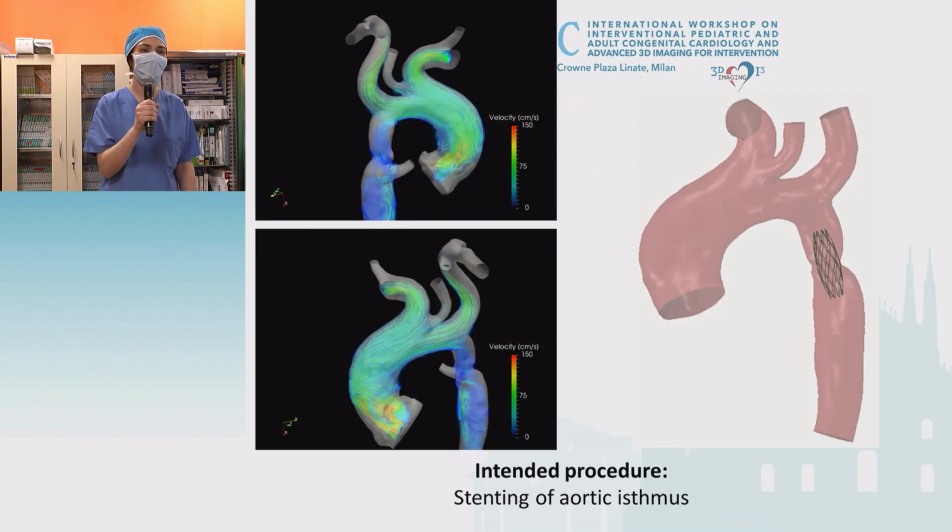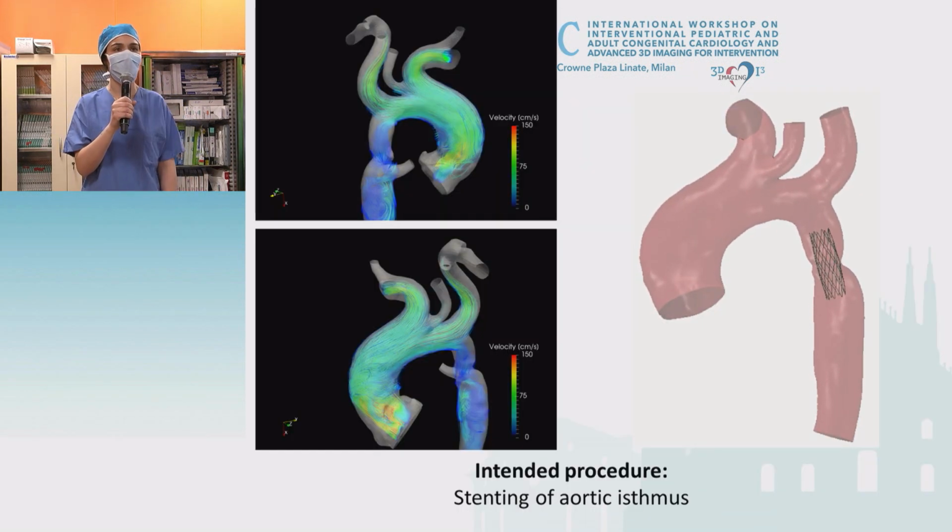So here, our bioengineering processes the imaging. You can see on the left the 4D flow acquired on MRI. You can see there's a particular shape on the ascending aorta that is probably due to the bicuspid aortic valve. And then there's actually not much of a flow through the narrowing part of the thoracic aorta. And indeed, in that part, the velocity is very, very low because of all the collateral circles.